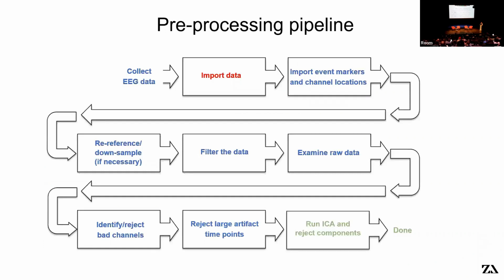So first, we need to import the data into the software that we are using to analyze it. How to do that always depends on the toolbox and the data format. But it's a problem that there are so many different data formats and also ways to annotate the events, for example, to record information on the data sets.